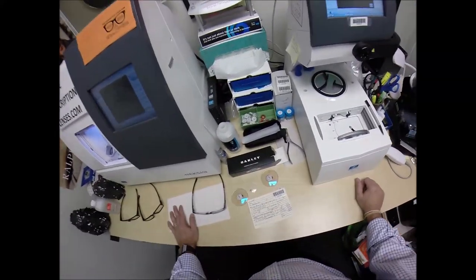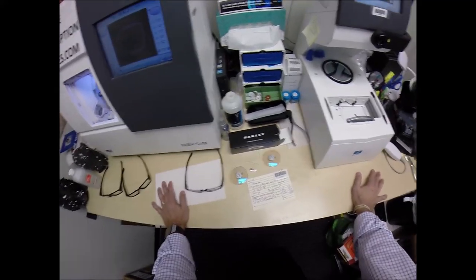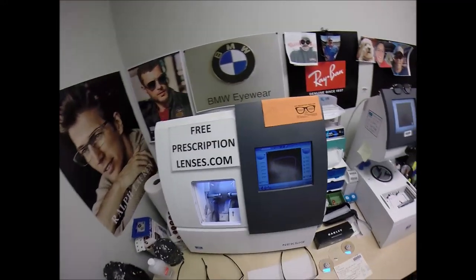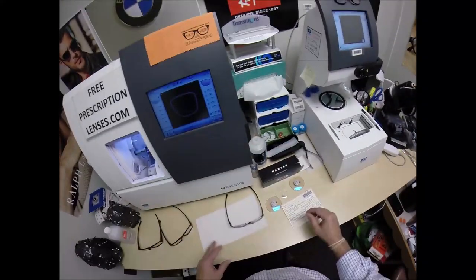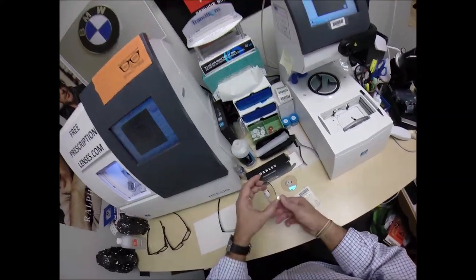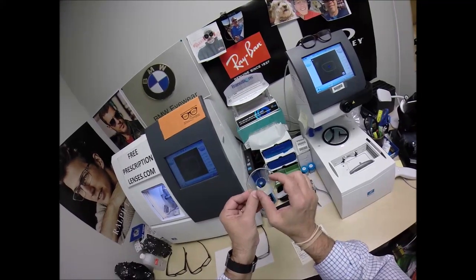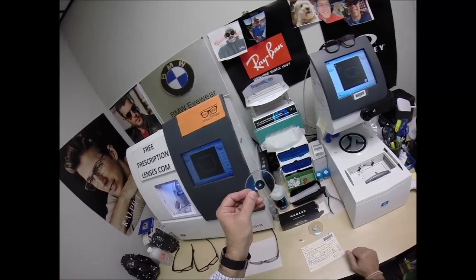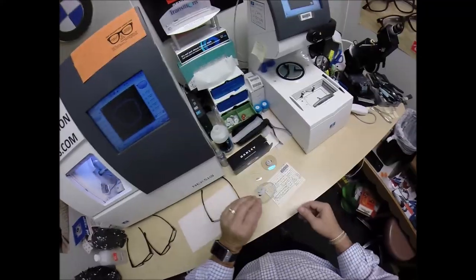You know, it's like Mercedes and BMW. You can't go wrong with German engineering, and same for Zeiss and Essilor. They both make incredible progressives. Now, single vision is less critical, but in progressives, it's always the speed at which you get to the reading and the width of the field of view in a progressive, and those are the two best companies out there.